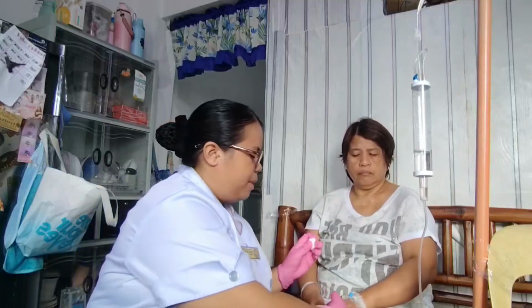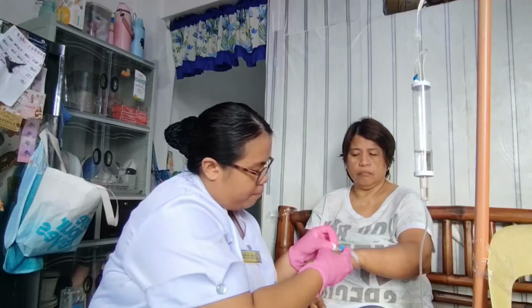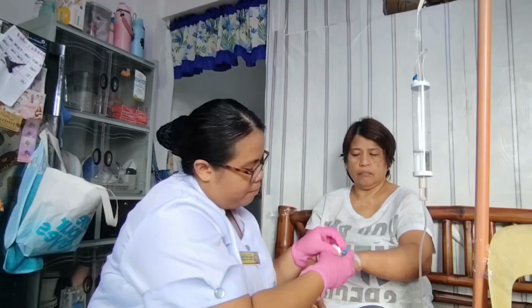Okay, so after that we will now proceed in disinfecting the main IV line or the Y port of the patient. Okay, dispose. Then after that, we're going to now connect the Solicet tubing into the HEP lock or Y port.